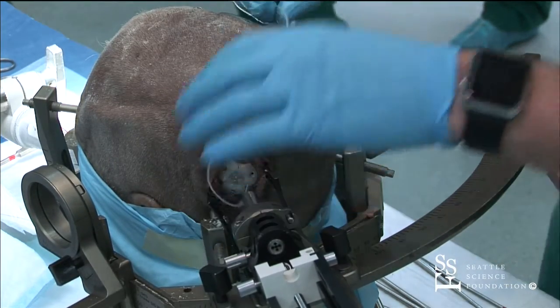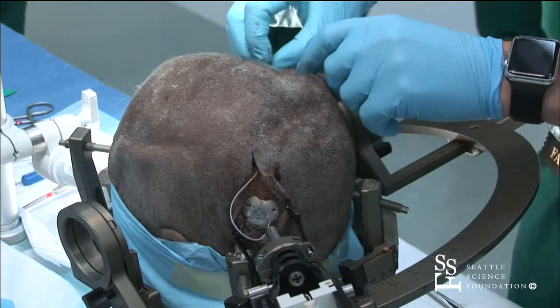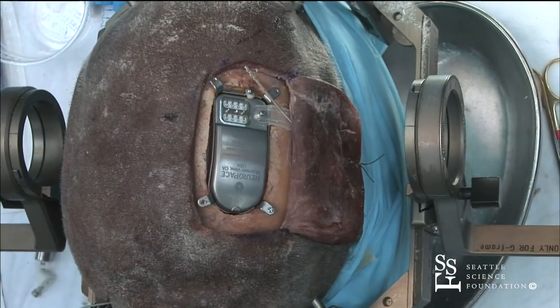And so again, generally we want to keep that electrode away. So I'll tuck it underneath the galea and bring it down. And now we have the electrode coming up to the IPG.